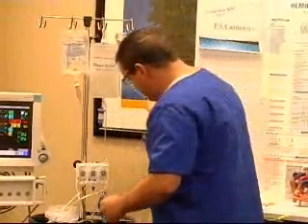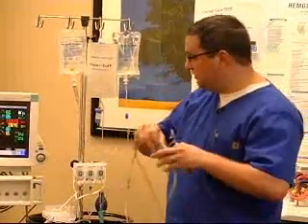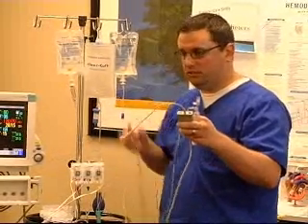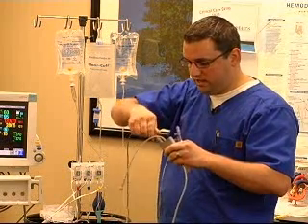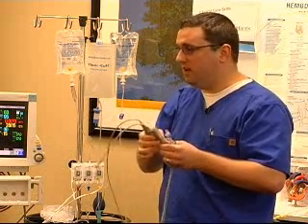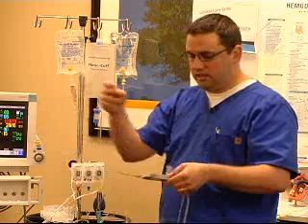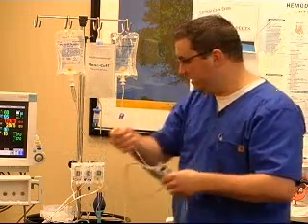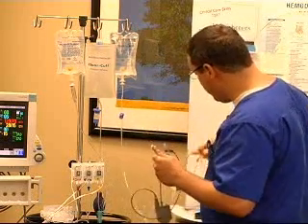The other component to this that you have to have is your cardiac output cable. Now, there's a piece that could be missing here. If you see a cardiac output cable that looks like this, you're missing the important part of the temperature probe right here. Hopefully those are staying with this, but if you end up with one that doesn't have that, you can't functionally do a cardiac output. The reason is this connects to the side here to give you the atmospheric temperature. This is going to connect to the temperature port on your PA catheter.